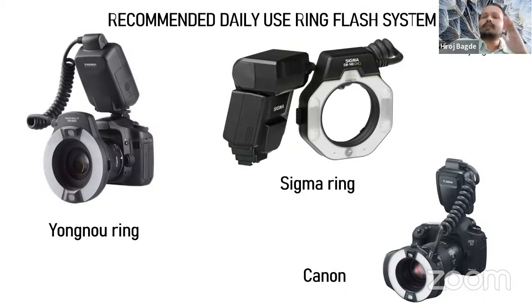So I will just suggest, please go and buy ring flashes. Ring flashes are cheap and they are even good whenever you are recording your cases. For anterior also it is good. It's not that it's not going to record, because you are going to click it and your image is definitely going to come. But I'll tell you, ring flashes are for daily use. You can use this cheaper variant.